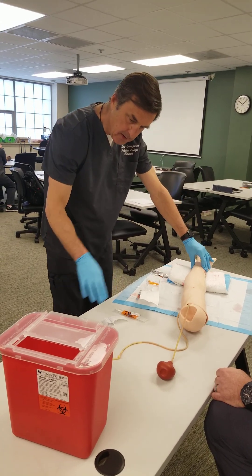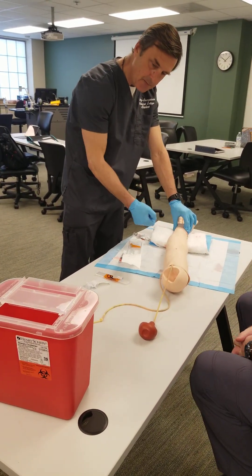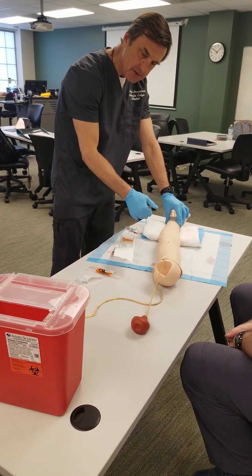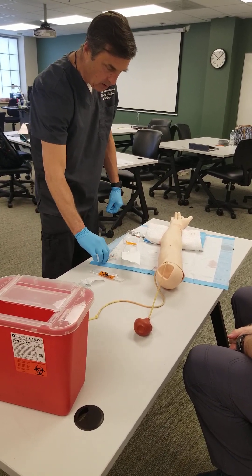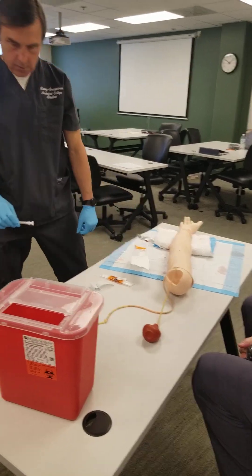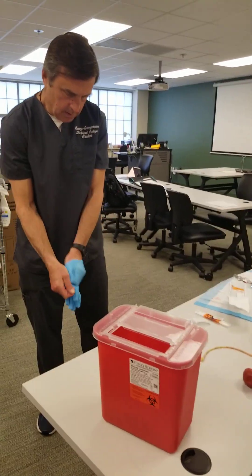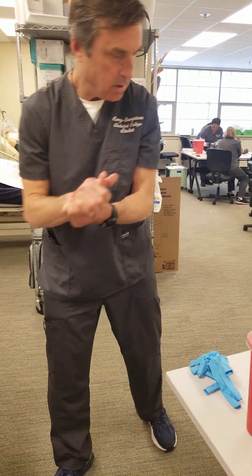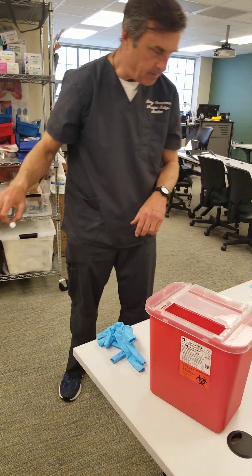No more bleeding. Mr. Johnson, you did really well — do you have any questions for me? Here's your call bell; if you have any questions for the nurse or me, just ring the bell. Then I'm going to leave the room, de-glove, wash my hands, and take this over to the ABG machine.